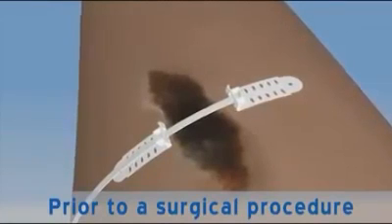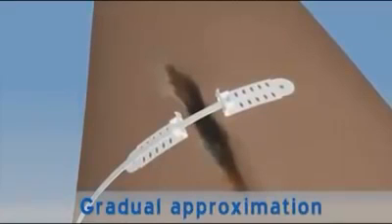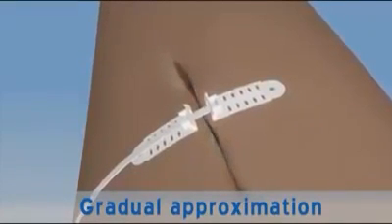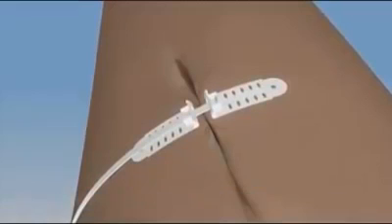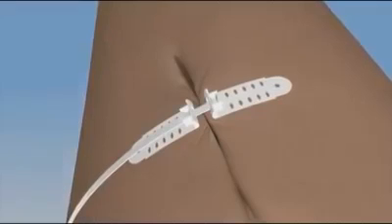The approximation strap is tightened gradually in order to enable uniform skin stretching and easy approximation of the skin edges under minimal tension. After skin stretch is complete, the scar can be excised and closed without tension.